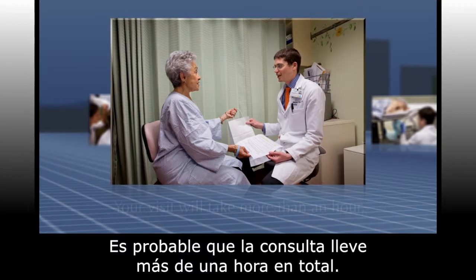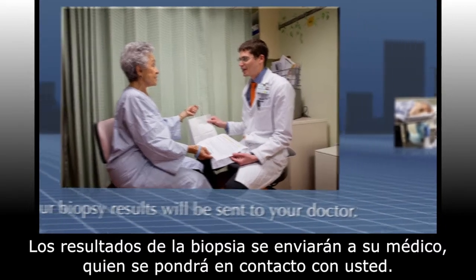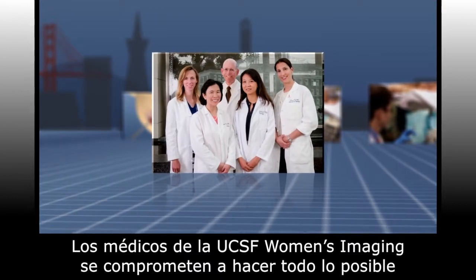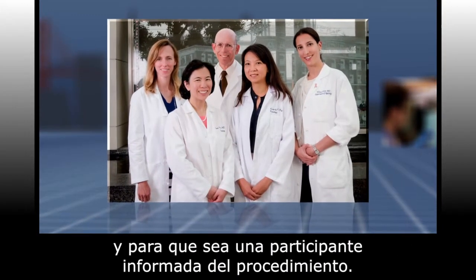Your full visit will likely take more than an hour and your biopsy results will be sent to your doctor, who will contact you. The doctors at UCSF Women's Imaging are committed to doing everything possible to ensure that you are safe and comfortable and that you're an informed participant during your biopsy.